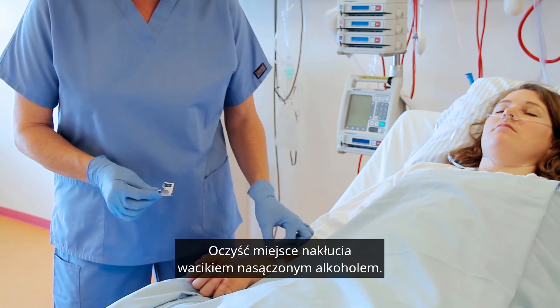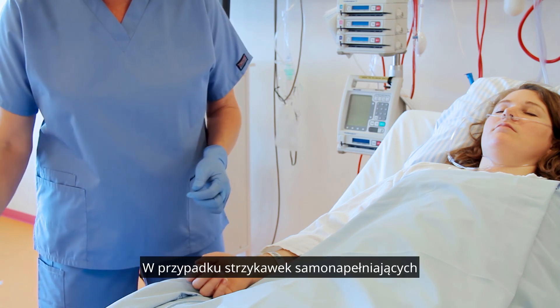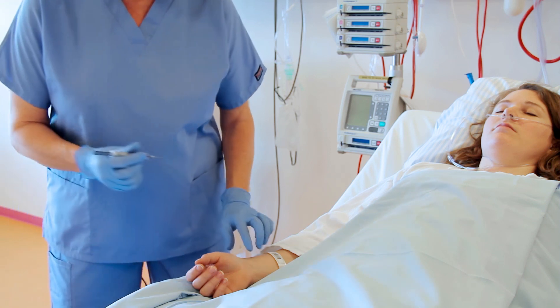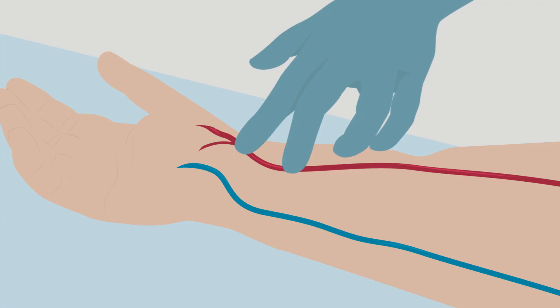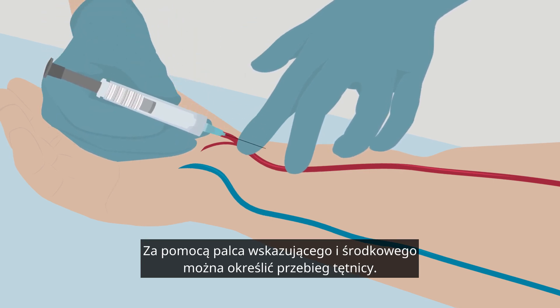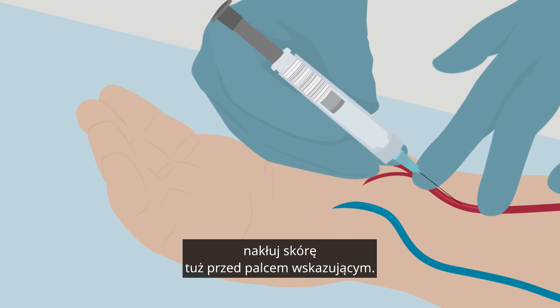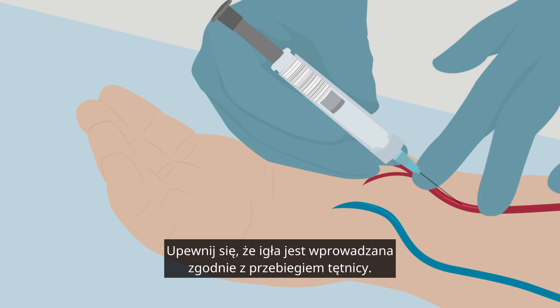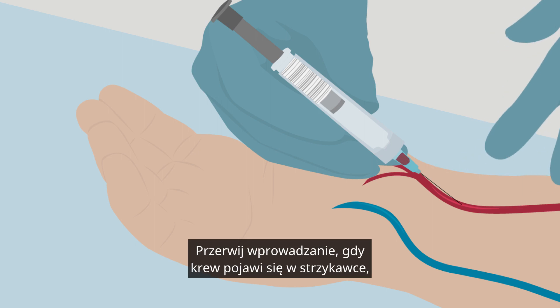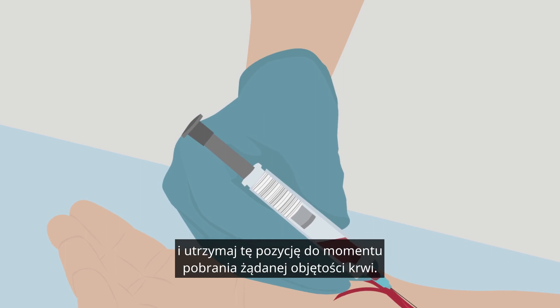Clean the puncture site with an alcohol swab. For self-filling syringes, preset the plunger to the recommended volume. Locate the artery again — you can use your index and middle fingers to identify the path of the artery. Hold the needle at a 45-degree angle or less and puncture the skin right in front of your index finger, making sure that the needle insertion follows the path of the artery. Stop the insertion when you see a flash of blood entering the syringe, and hold the position until you have collected the desired blood volume.